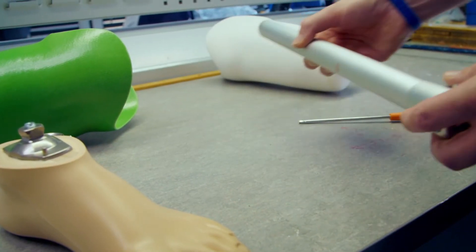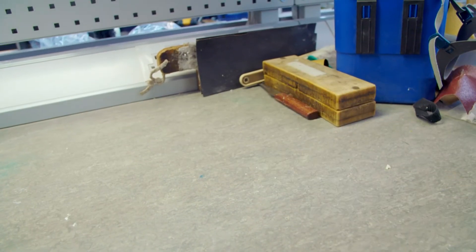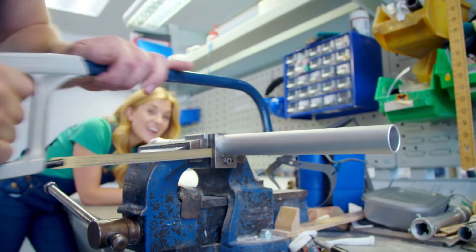Here we are. But first, Adam needs to cut the shin tube so the prosthetic leg can be the right length. And for that, he's using a saw. There it goes.